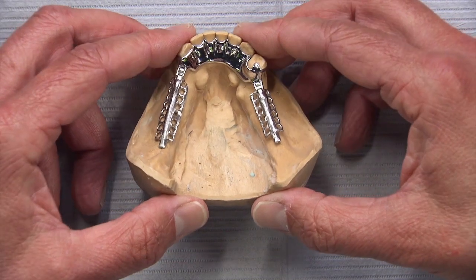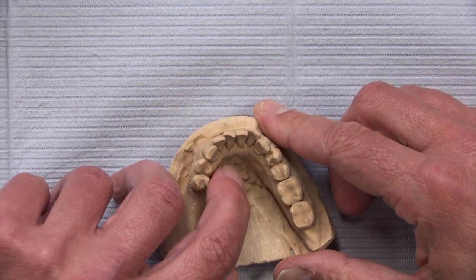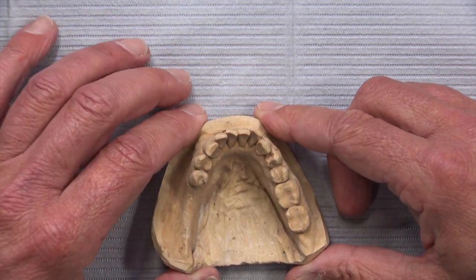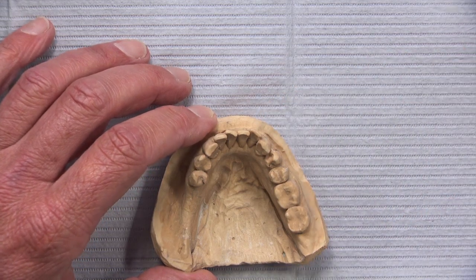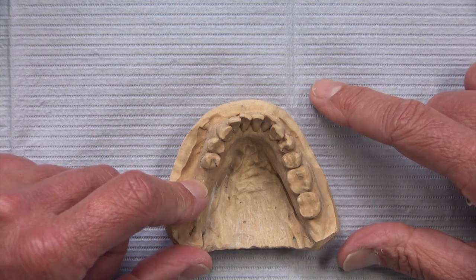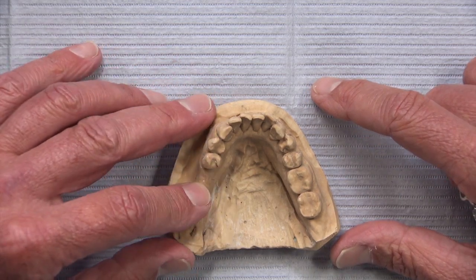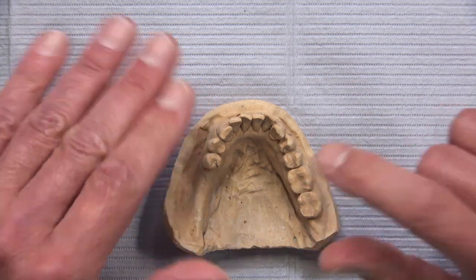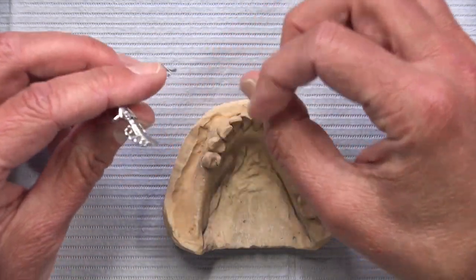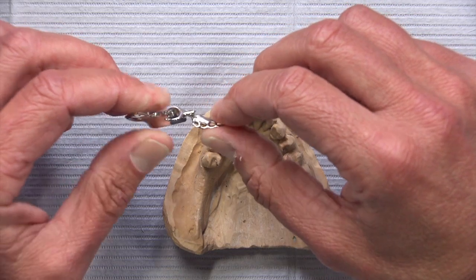There was another case sitting right next to it — again the same kind of thing: tori on both sides, and some rest preps provided by the doctor, which is nice. We're going to do another lingual plate to avoid the tori. But here we have just a unilateral edentulous space. The concern is that as the patient loads the denture on this side on teeth 18 and 19, the right side is going to rock and dislodge because all the force on the partial is coming from one side.